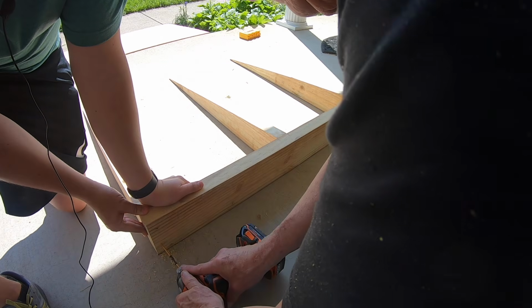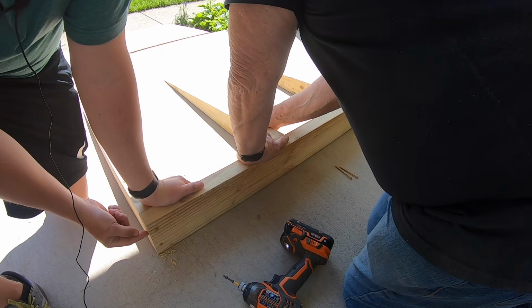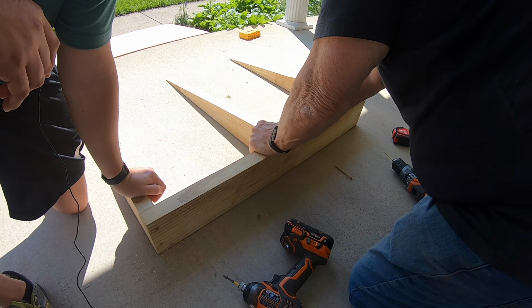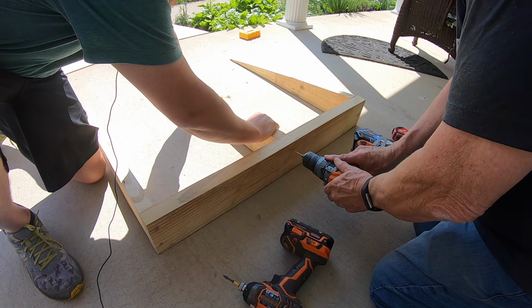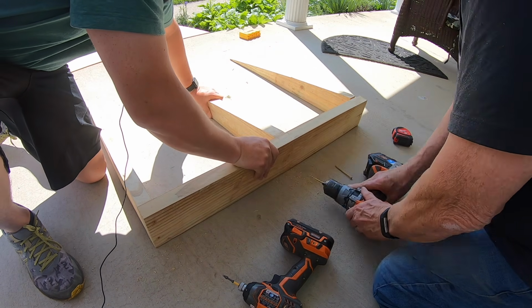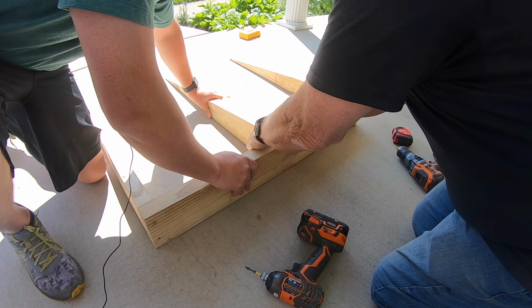Good. Yep. Because you do not want to crack the side of your wood, so pre-drilling does help out a lot with that. It's a really simple thing to just go ahead and make sure that is exactly where you want it to be. Pre-drill the next one, same concept. And hopefully have somebody holding it like I didn't do there. You will want push pressure on both sides to make sure it does exactly what it needs to.